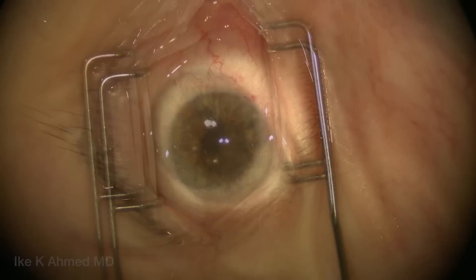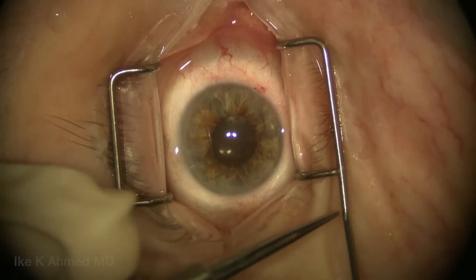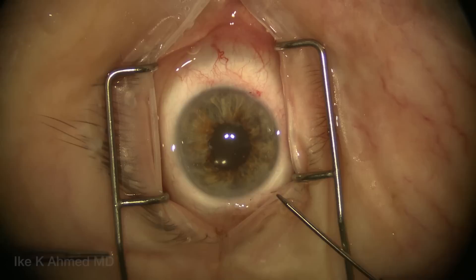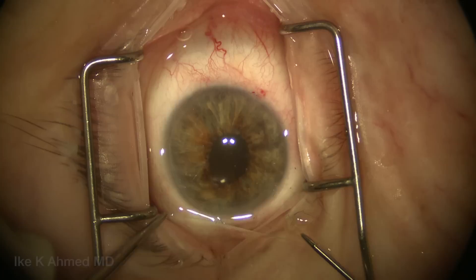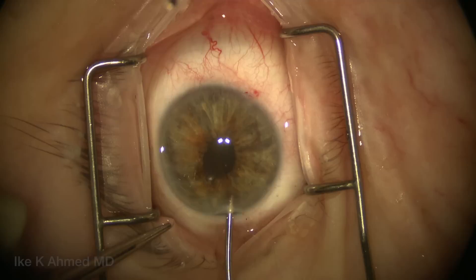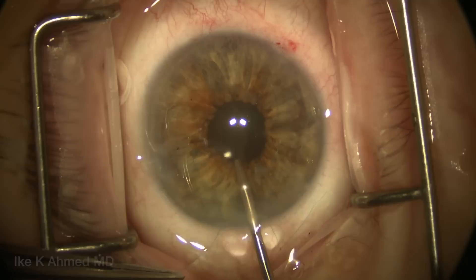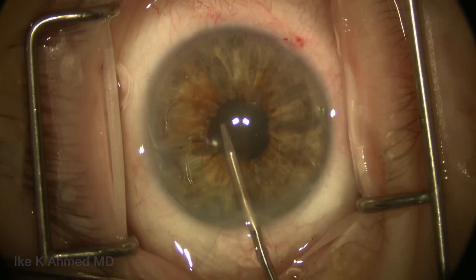Along the temporal side of the eye, the long end is grasped with a traditional straight tyer while a micro tyer loops around itself with the long end, grabs the short end, and cinches the knot to form a tighter knot as it's brought into the anterior chamber. We then slide the knot with micro graspers into the anterior chamber — through the main incision or a side port — to pull the short end into the eye, bringing the knot toward the pupil margin, and tighten it to approximately a 3.5-millimeter pupil size, which is our planned aperture.